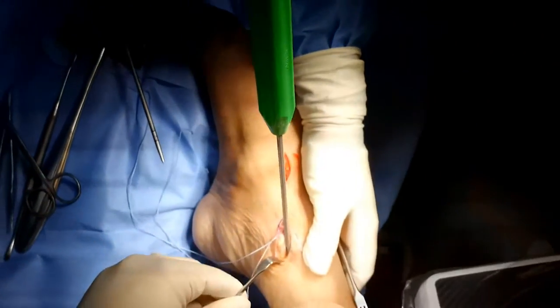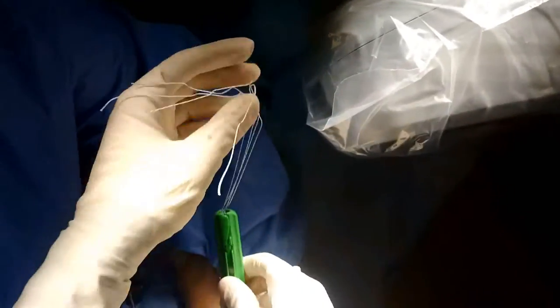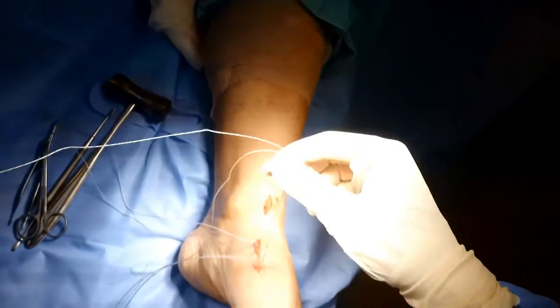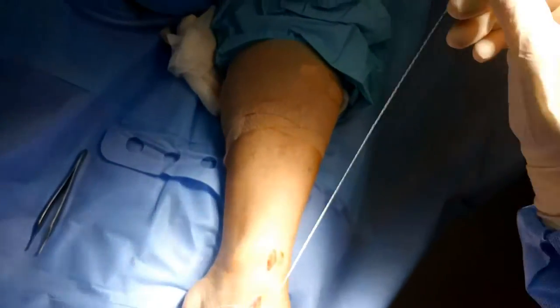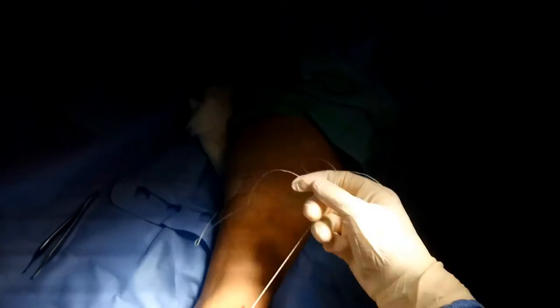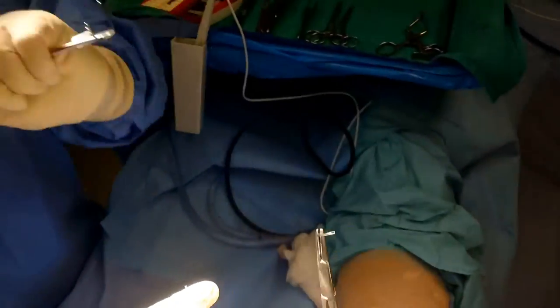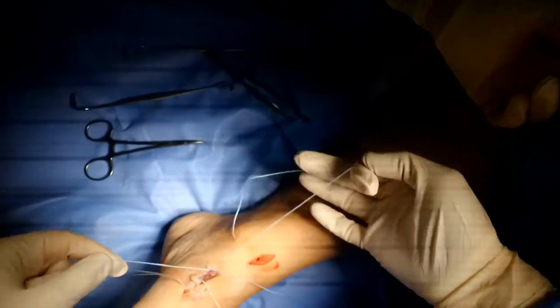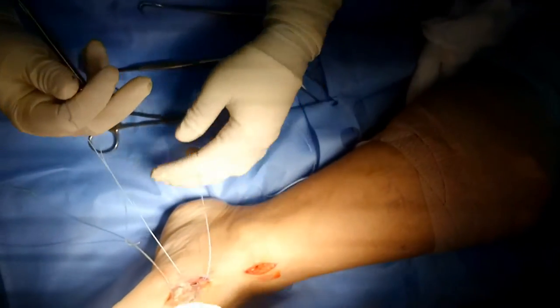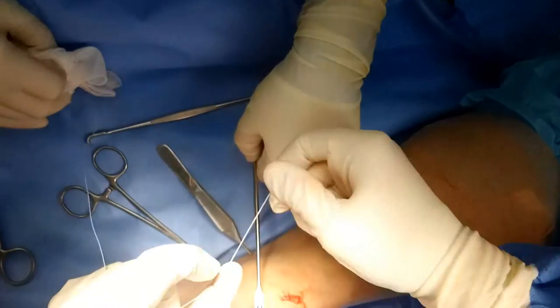The two are now put together. Make sure when you are tying the ends that the ankle is going to be kept in more of a dorsiflexed position. Remember, the knots are the weakest part of this whole structure. There are other techniques with fewer knots, and some newer technologies with sutures that can be anchored directly into the bone without even having knots — those are good options too. If there is a piece of insertional tendon left, any sort of nub, I recommend stitching that into the whole process. A surgical tech is typically really helpful in this scenario to hold your knots down to make sure they stand nice and tight. Remember to hold that ankle dorsiflexed — I typically use my belly — and splint it in a dorsiflexed position. Otherwise, you risk rupturing the entire repair.